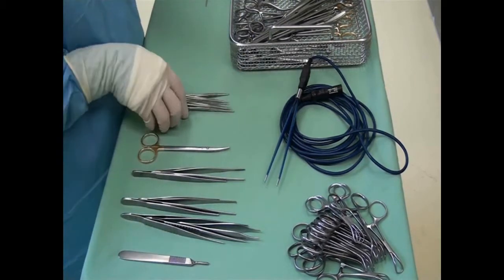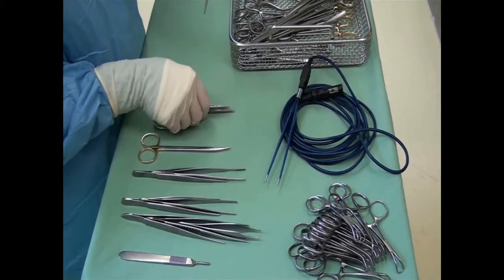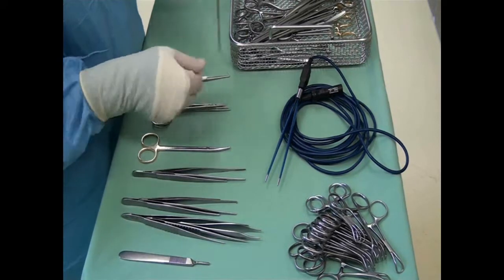Then several small hemostats are arranged. These are also known as mosquito forceps.